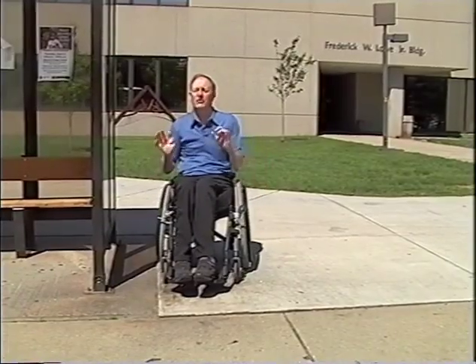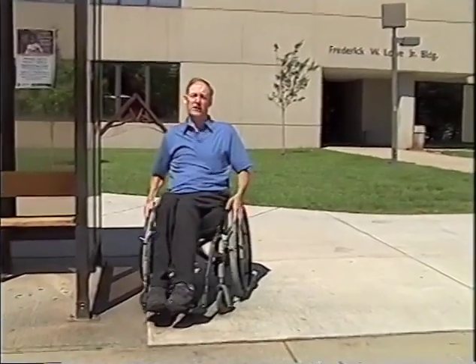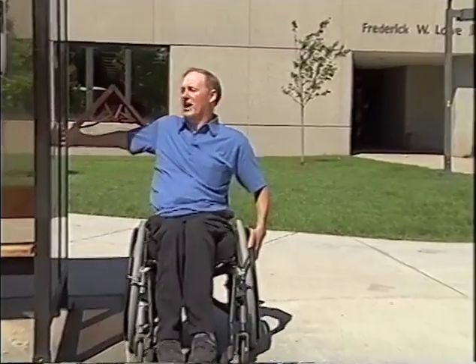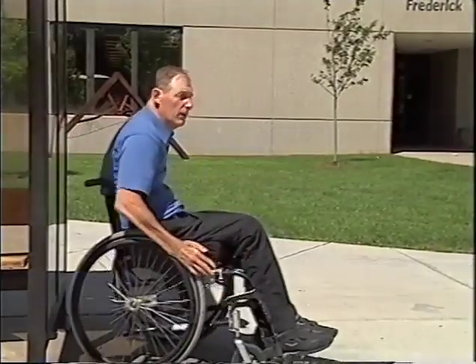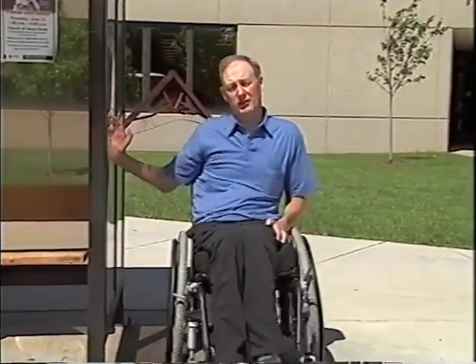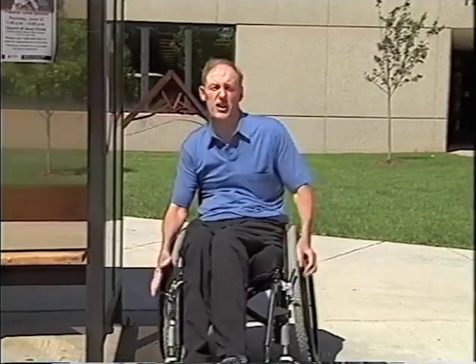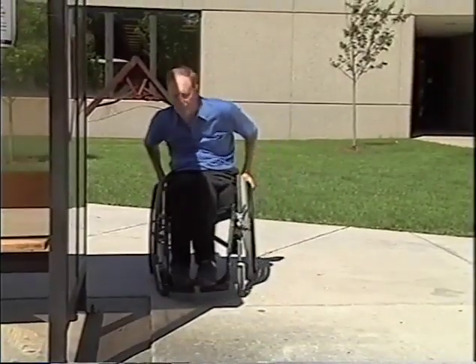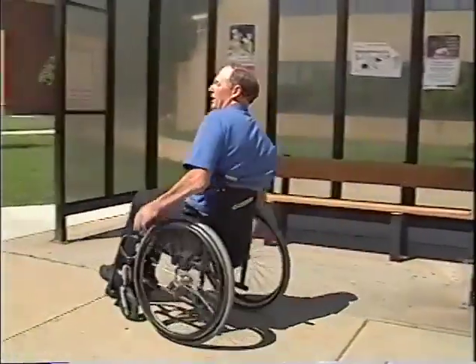And the reason for that is also you're taking the weight off the front end, making it lighter to turn side to side, and then you're putting your arm behind you to push back, or in front of you to make a left turn, but not alongside of you. Pushing alongside of you does nothing to the chair. So just wheel along easy, reach back, and push, and you've got it.